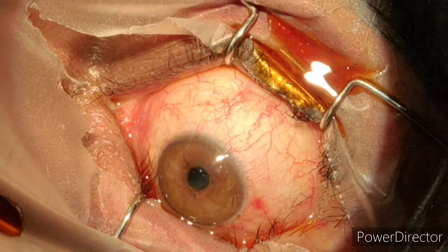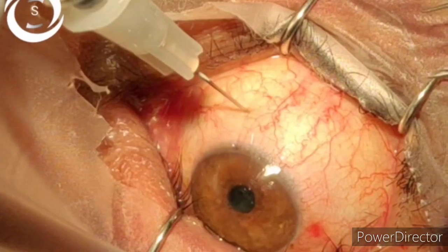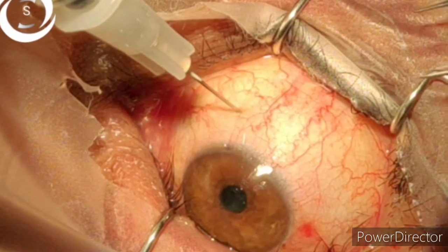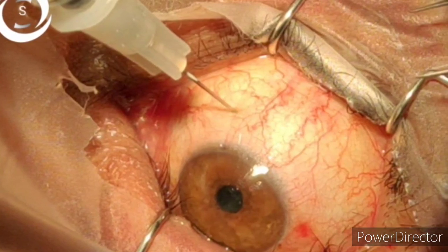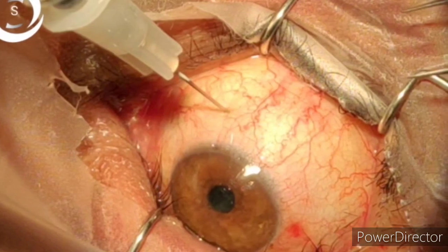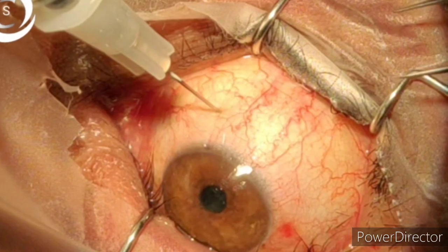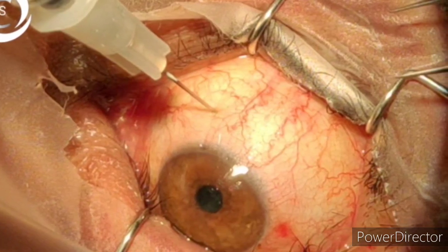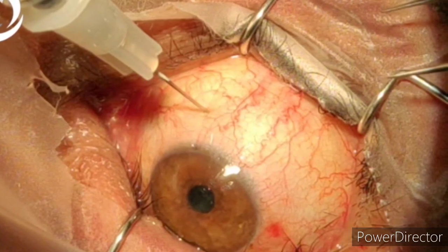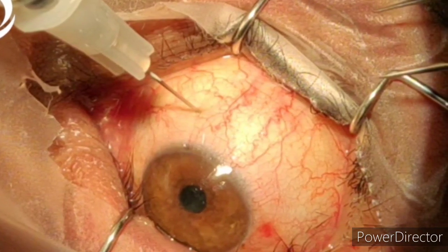The dreadful one is endophthalmitis, and the others are retinal detachment, which is also rare. The common ones are subconjunctival hemorrhage, pain, bleb formation, and transient elevation of intraocular pressure, and sometimes central retinal artery occlusion as well. So I hope now it is clear how we should inject intravitreally into the eye.